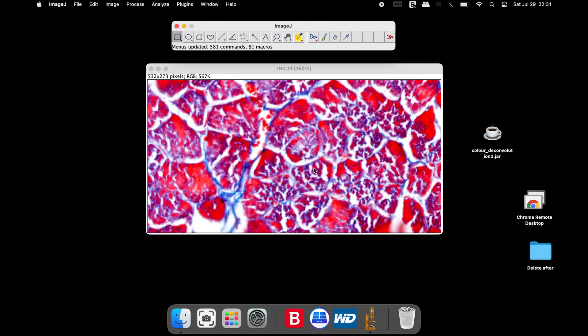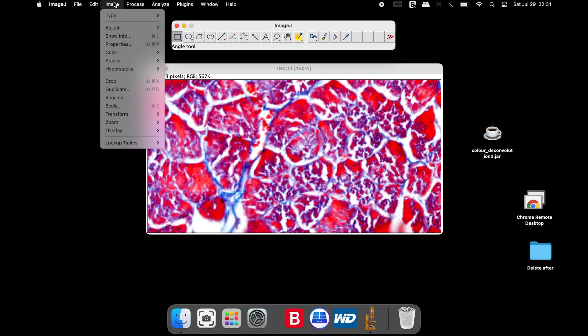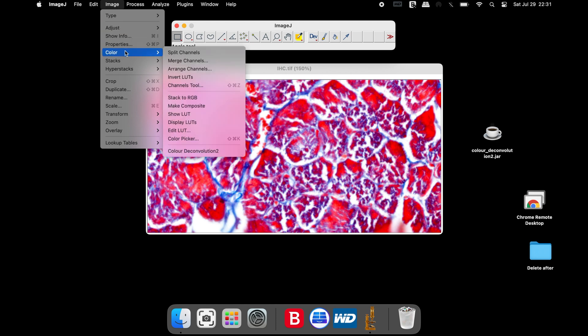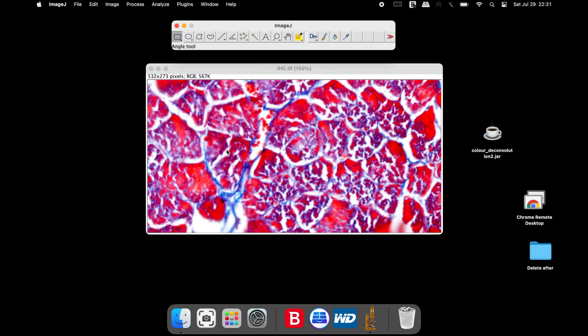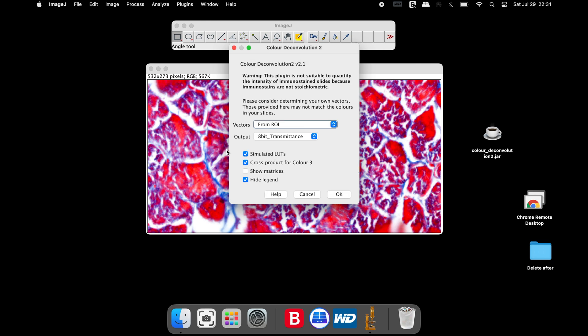To confirm the plugin installation, click on Image and Color. If the plugin installation is successful, users can see the Color Deconvolution 2 plugin here. To quantify the collagen stain in blue, click Color Deconvolution 2.